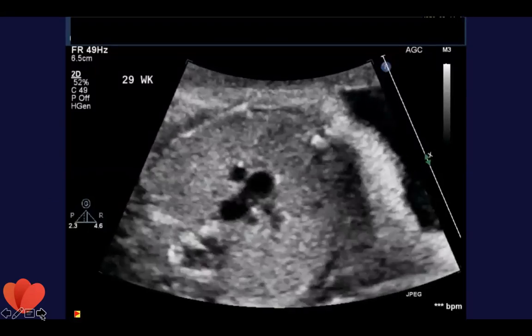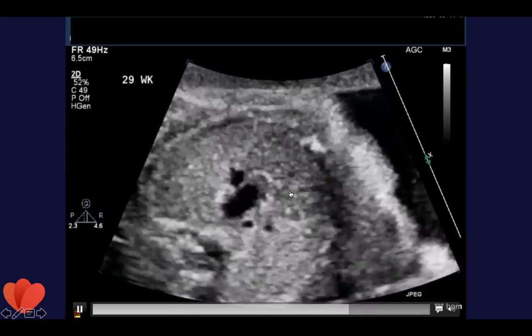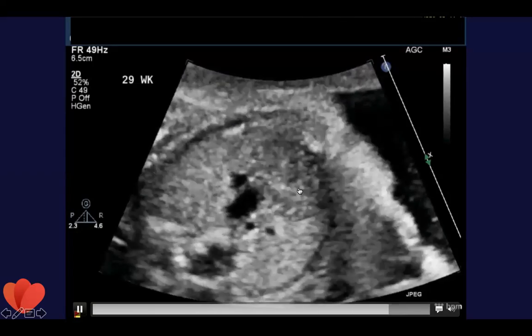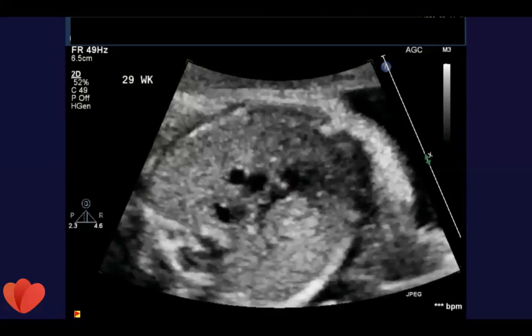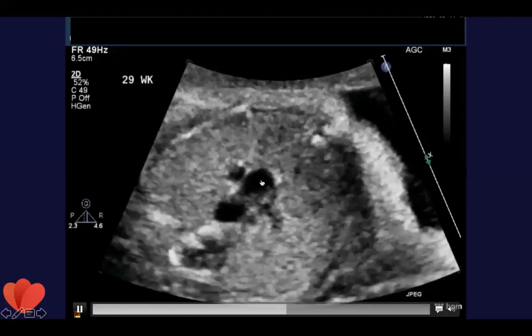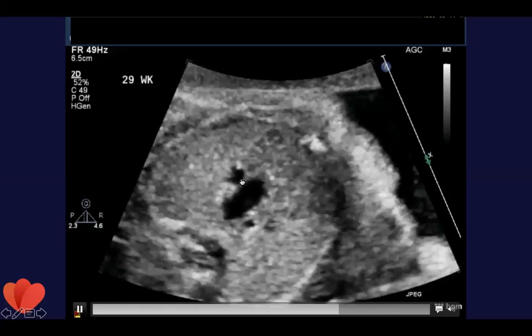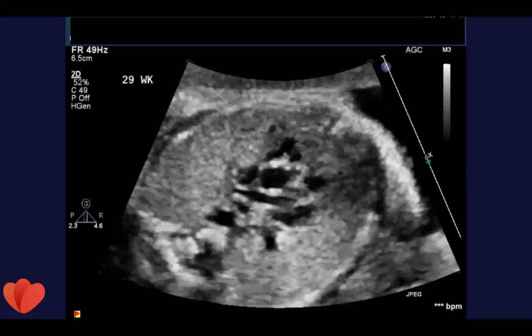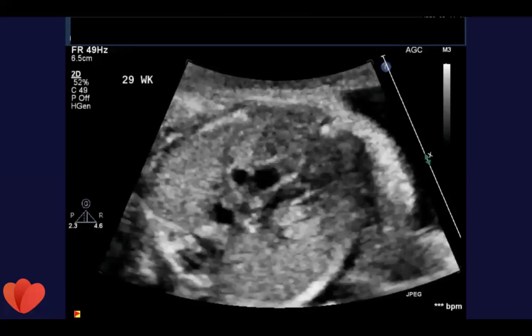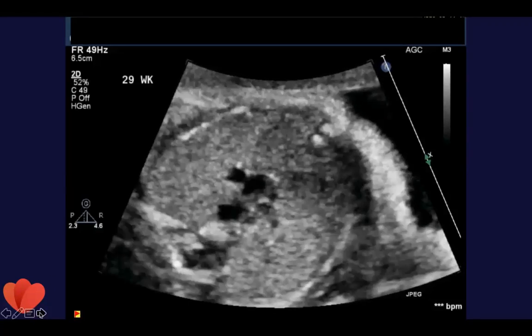So again, when we looked at this four-chamber, it looks pretty normal too. Sometimes you can nicely, in just the four-chamber, see the hole, so that can be a tip-off that you're dealing with something. But the four-chamber looks, again, usually normal if it's a shallow VSD, but then as you sweep up, you can really see the difference between the pulmonary valve, the aorta, and the SVC. So the arrangement of the great vessels is correct or normal, but there's a huge size discrepancy between the pulmonary and the aorta. That's why I think these are very nicely picked up in the three-vessel view.